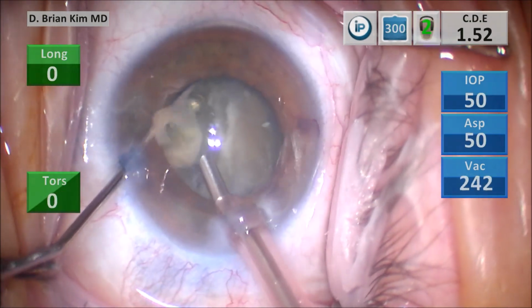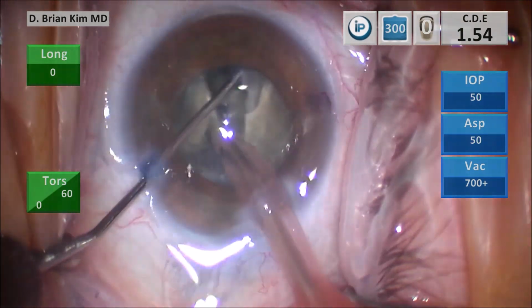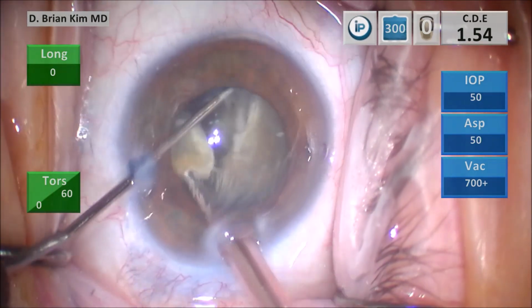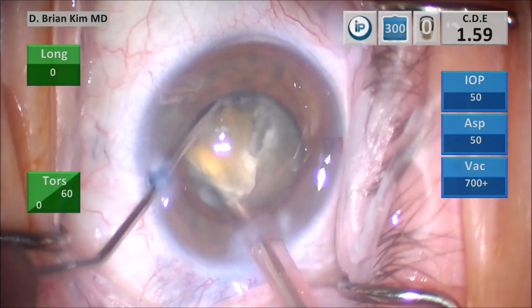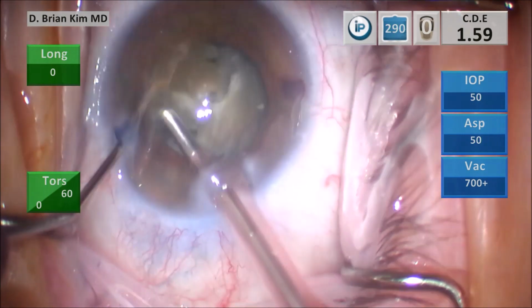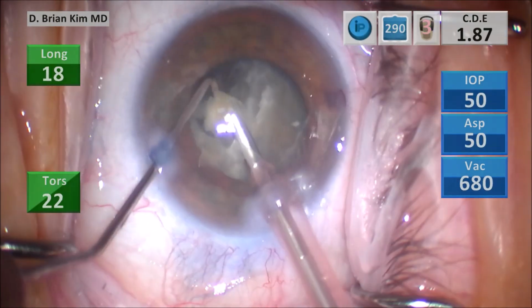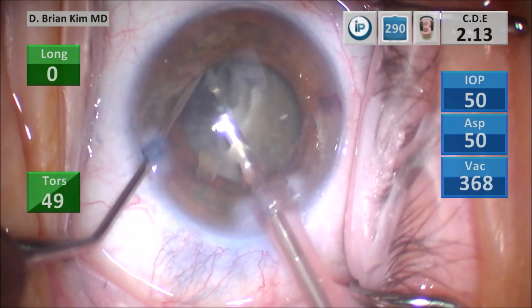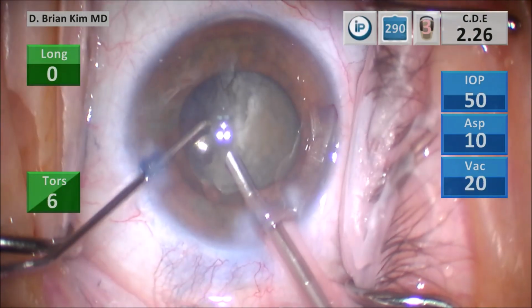So again, I'm just getting around it and then just spreading, separating the two instruments to separate the two lens pieces. Again, because it's such a thick lens, you can have pretty deep posterior attachments there. Get the instruments around that lens piece, crushing it and dividing that second quadrant now, using a little bit of vacuum to hold the lens piece, and then emulsify the lens piece. Okay, so that's the second quadrant, which is gone now.